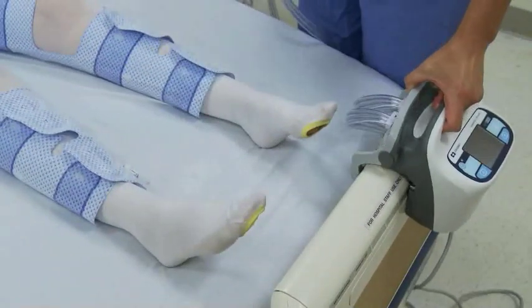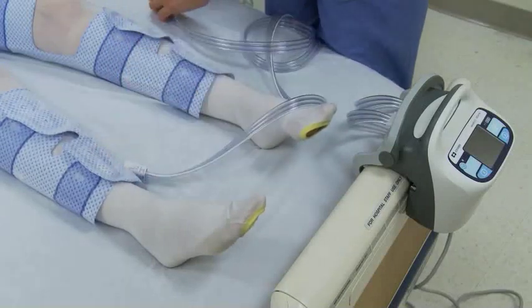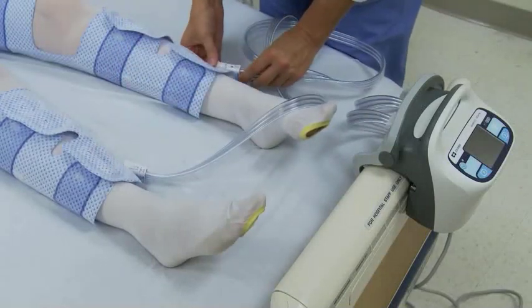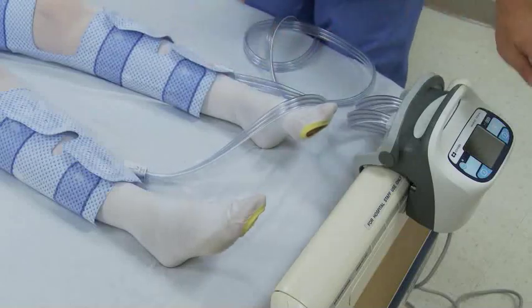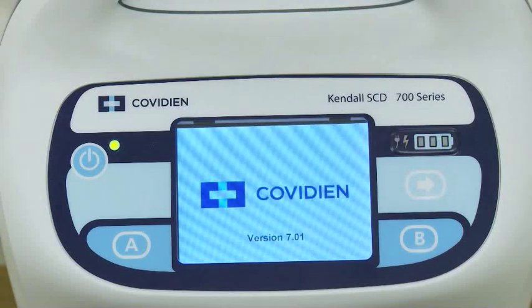To use the pump, simply apply the sleeves to the patient's leg, connect the sleeves to the tubing, and connect the tubing to the pump. Press the power button to start the pump.